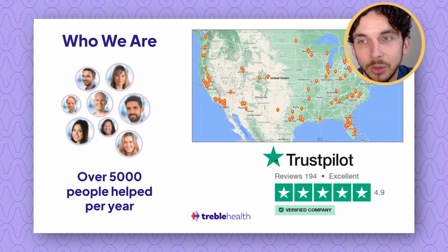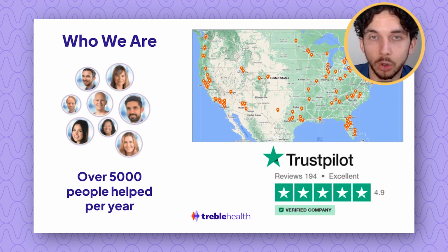That led into offering services via telehealth over Zoom directly to patients. And then we started to work with medical devices for tinnitus. And fortunately, they have remote programming capabilities. So we're able to send these devices to the patient's home. And based on a recent in-person hearing test that they've had, we're able to modify and adjust and program those devices on the ears to be fine-tuned for their needs.